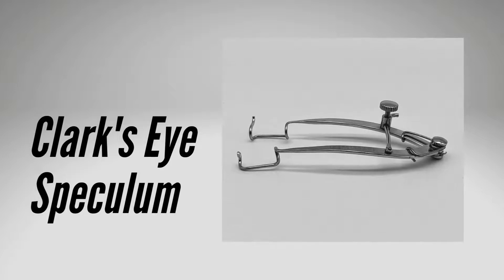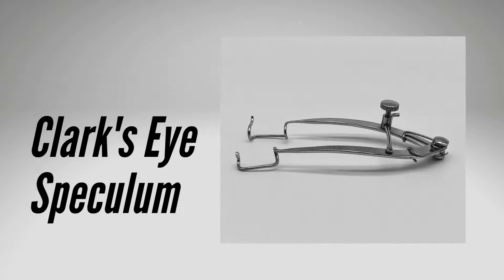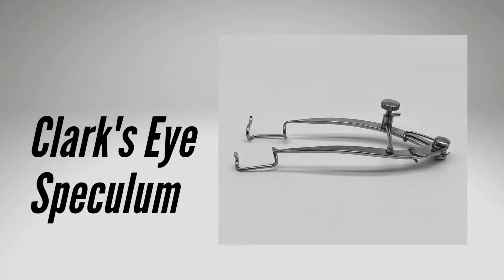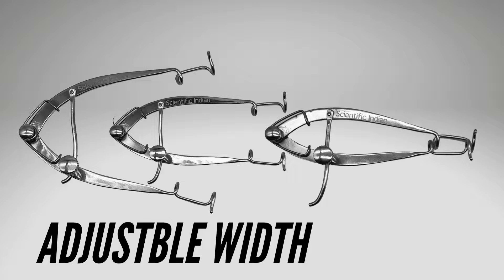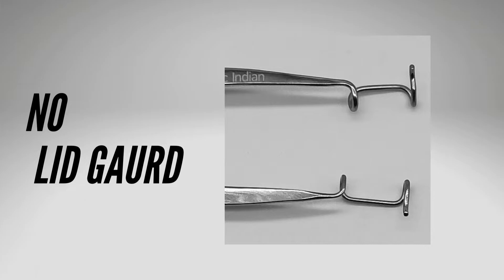Clark's eye speculum also allows for adjusting the width of the palpebral fissure. It is useful in cases requiring exposure of a larger field of surgery like oculoplasty or strabismus. However, it does not have guards to keep the eyelashes away during surgery.